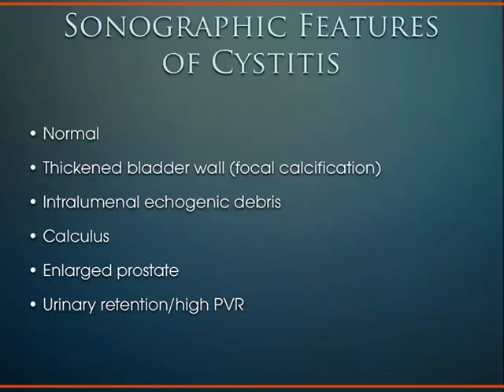You can also make a diagnosis of a bladder infection or confirm the diagnosis. Again, usually a very clinical diagnosis, but sometimes the patient can't talk to you, or they're too young, or they're intubated, and you're wondering why they have a fever. And you can look, as you're doing your fever survey with ultrasound, you can come down to the bladder and you'll see a thickened bladder wall.